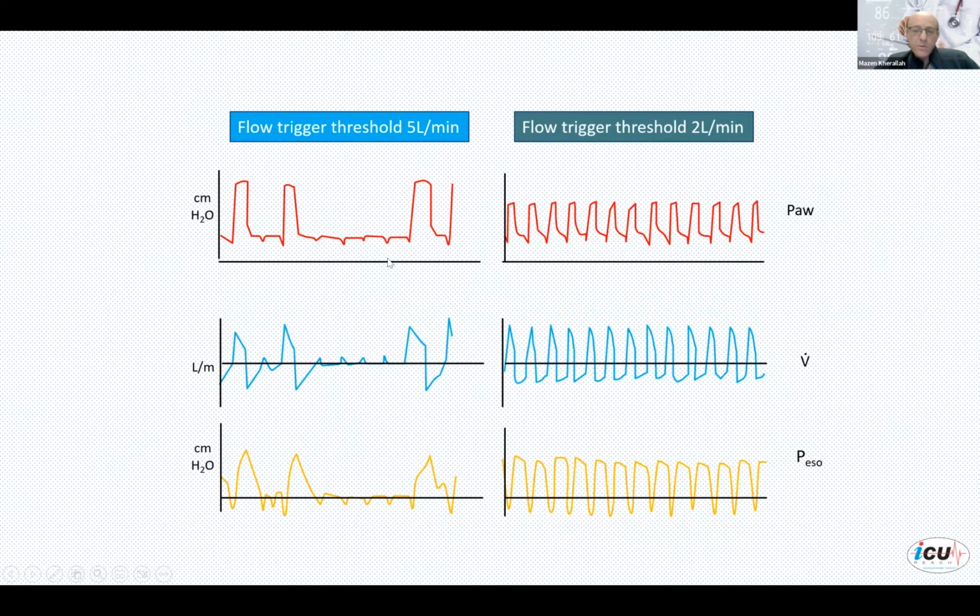And now when you responded to every single breath the patient is doing, now the ventilator is triggered every single time when he drops the pressure. He's breathing at very fast rate, and look at the flow. In the expiratory flow, you're not giving the patient enough time to exhale all the way, and you generated a dynamic hyperinflation syndrome for the patient.